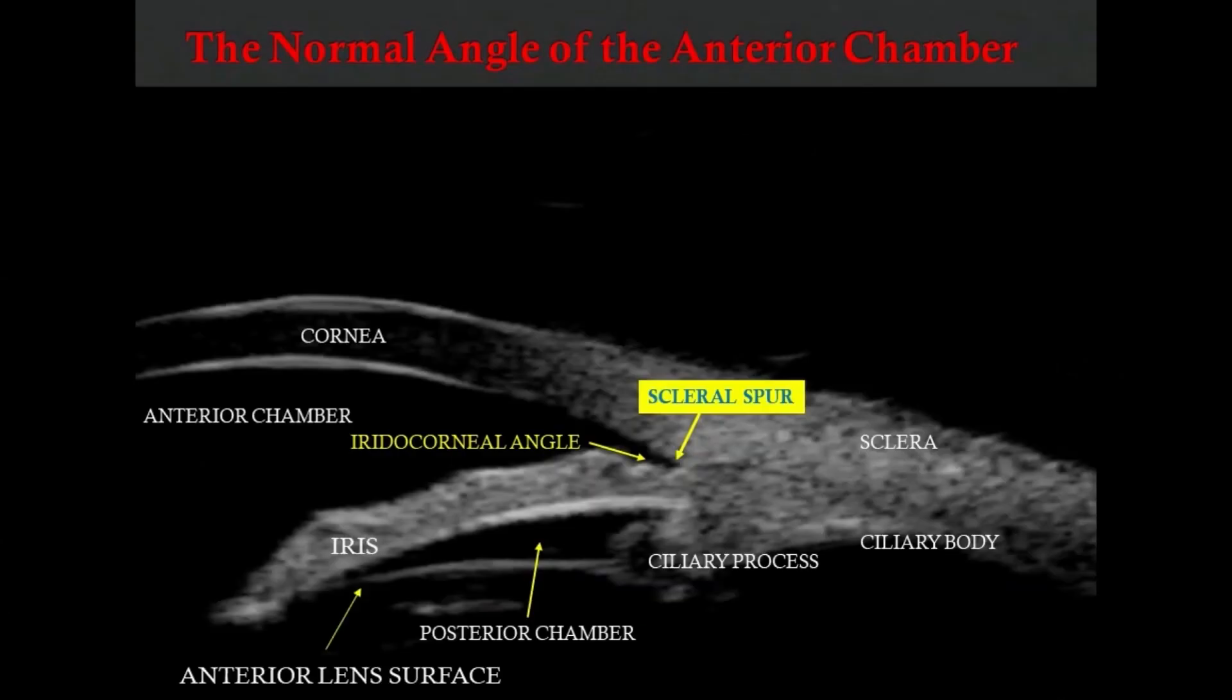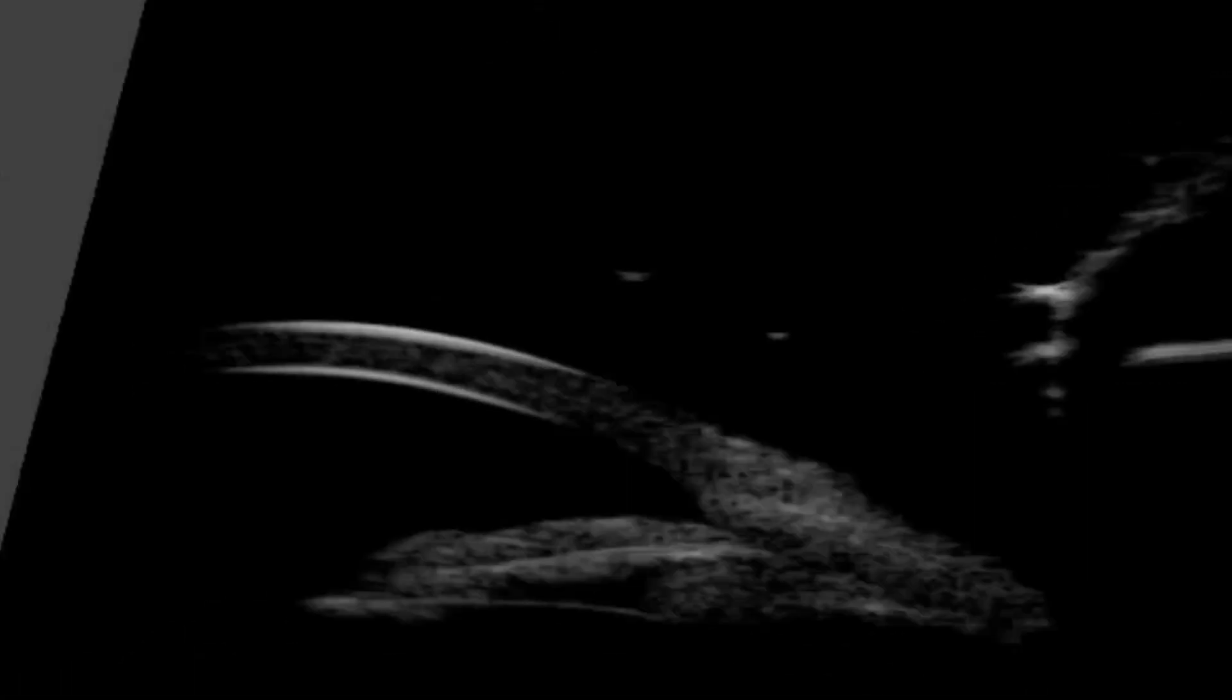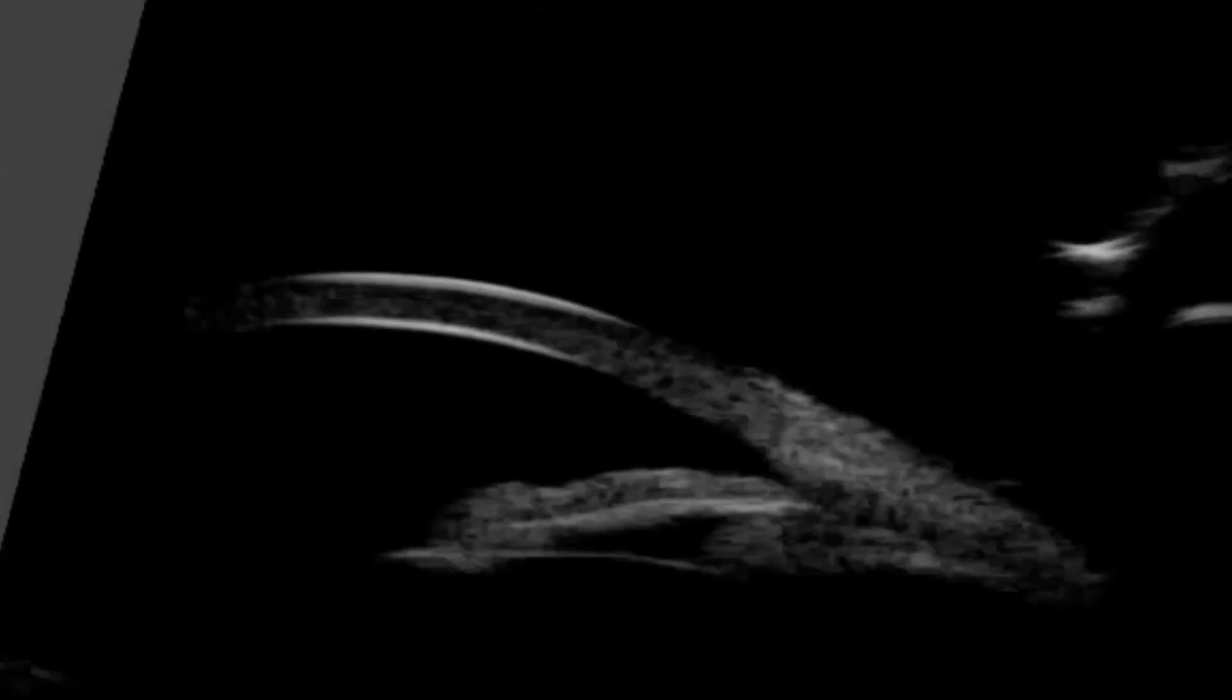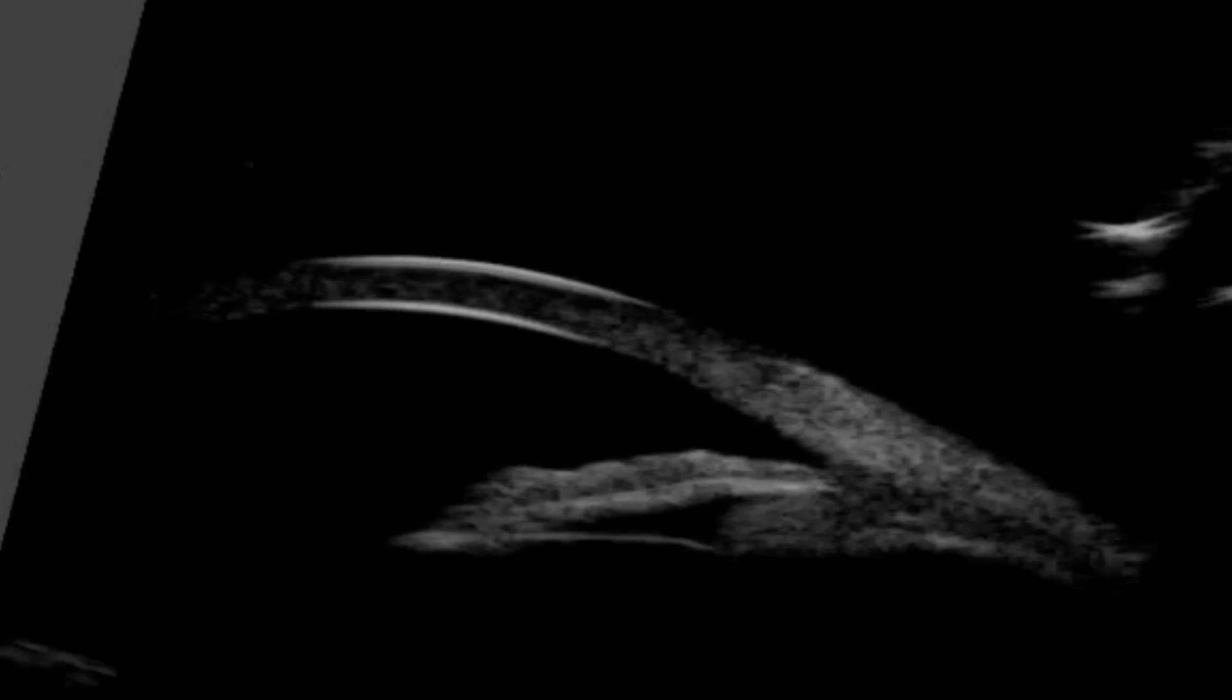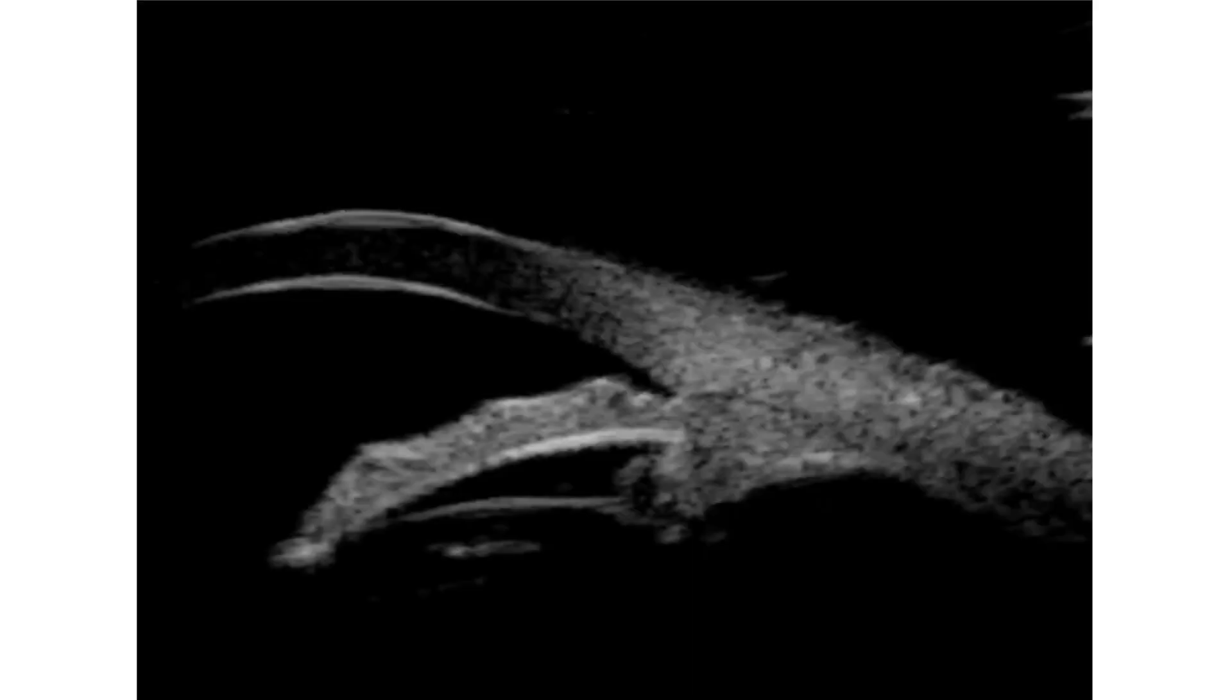This UBM image is taken through a typical ciliary process and gives a cross-sectional view through the anterior chamber angle region of a normal subject. This is obtained by orienting the probe in a radial fashion at the limbus. The scleral spur is the most important and the only constant landmark in the angle structure. The scleral spur is located where the trabecular meshwork meets the interface line between the sclera and the ciliary body traced to the anterior chamber.